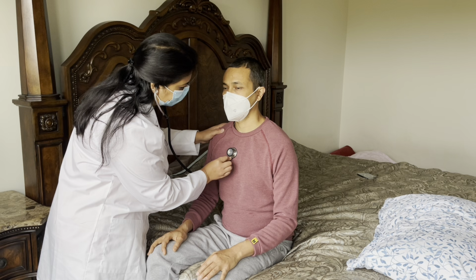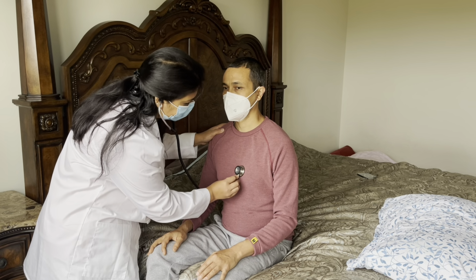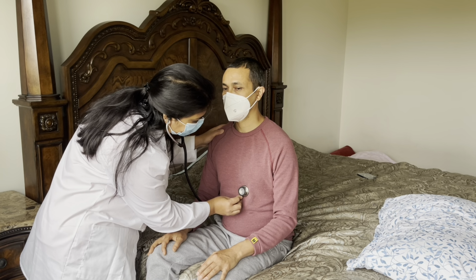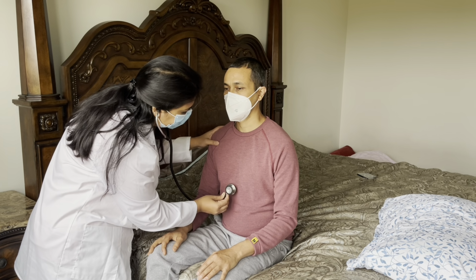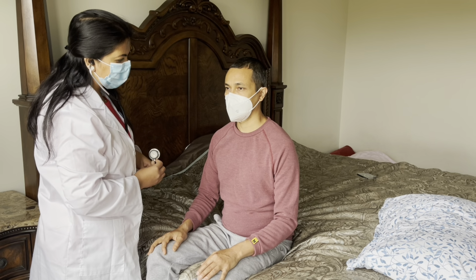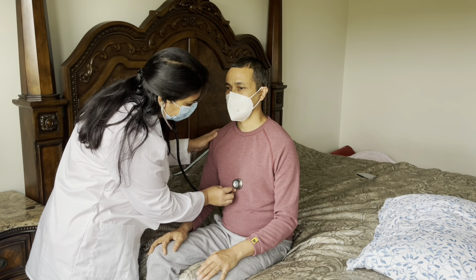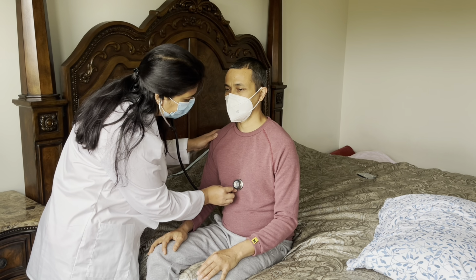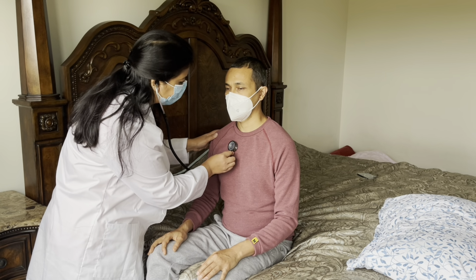Starting from here, this is aortic, this is pulmonic, Erb's point, tricuspid, mitral, and so on. In those 5 areas I hear S1, S2. I did not hear S3 and S4. And then this is epigastric, we check here if we get a swishing and blowing sound. I don't hear any. I'm going to repeat with the bell of my stethoscope.